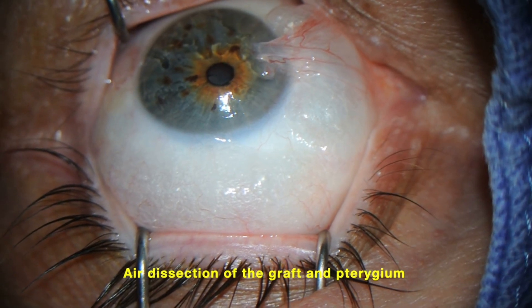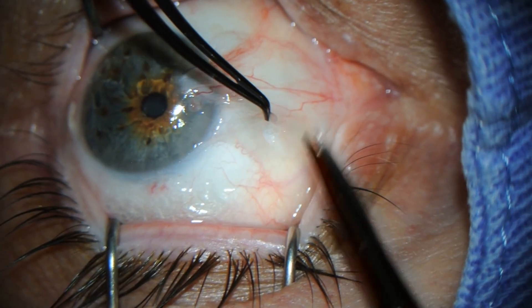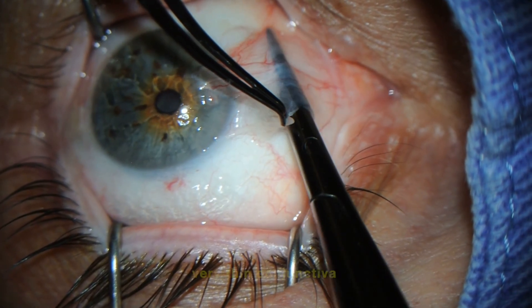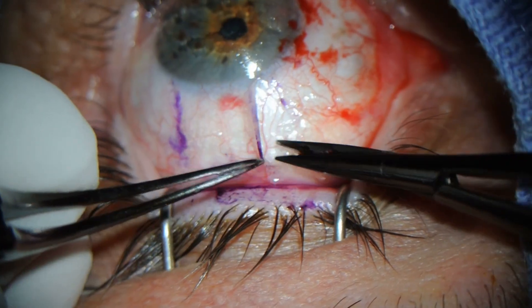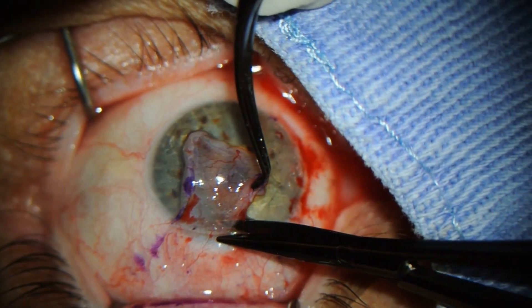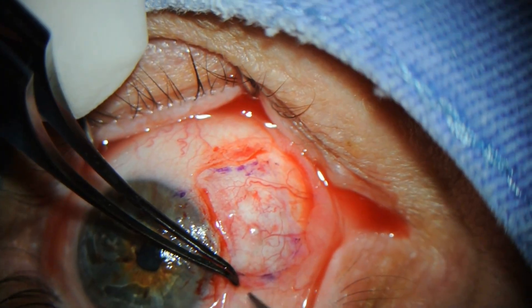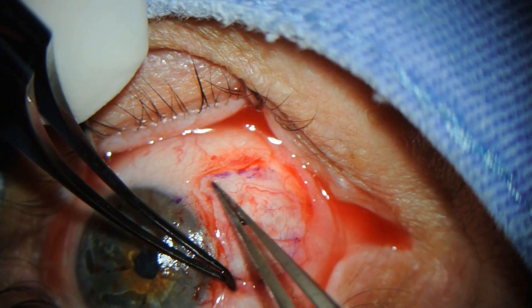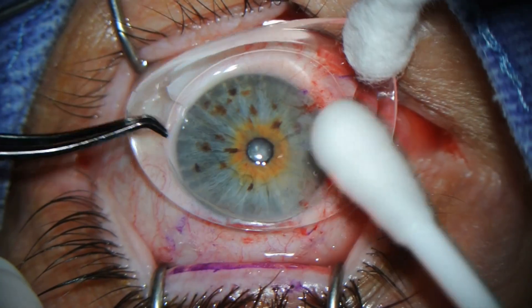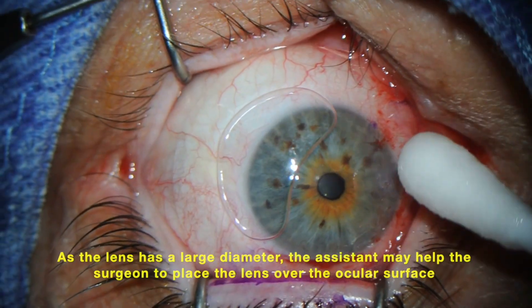In this patient, we can see the air dissection of the graft and pterygium. Here we see the very thin conjunctiva being dissected. As the lens has a large diameter, the assistant may help the surgeon to place it over the ocular surface.